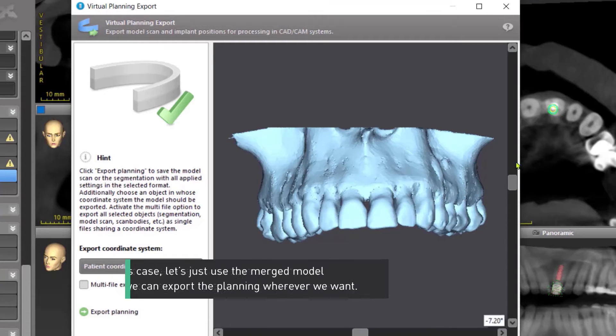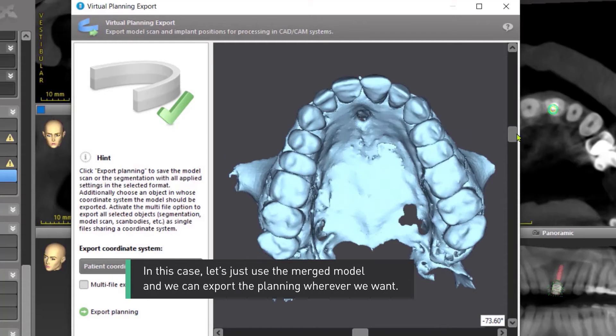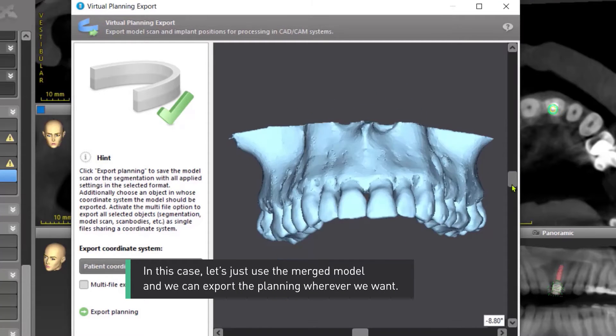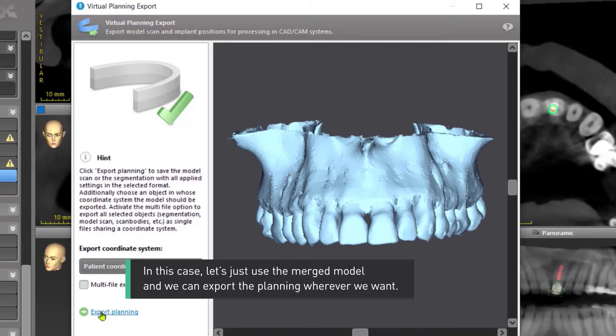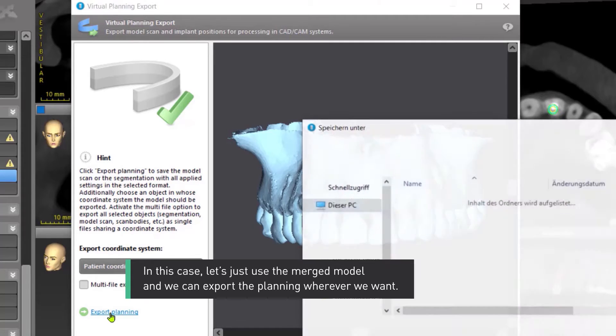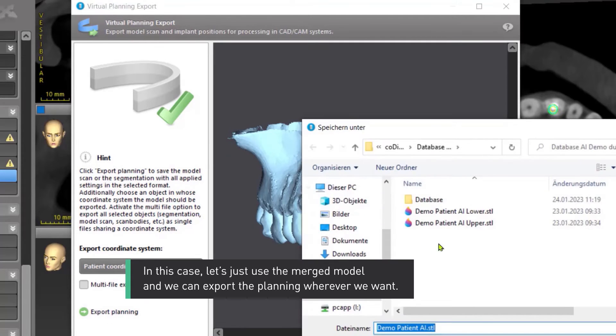Let's export the complete model. In this case, let's just use the merged model. And we can export the planning wherever we want.